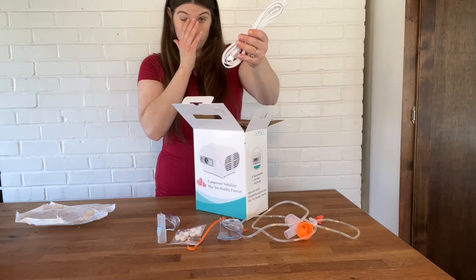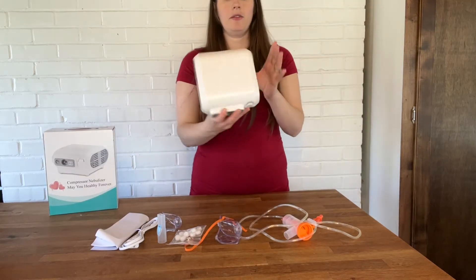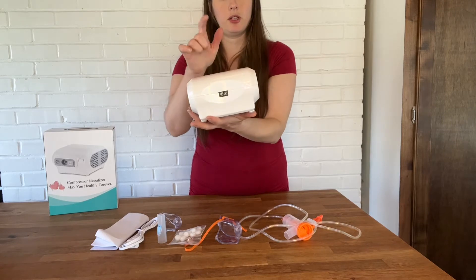Those come with an elastic headband. You also get some filters, your charging port and cable, instruction manual, and then you have the nebulizer itself — this is where you charge it.